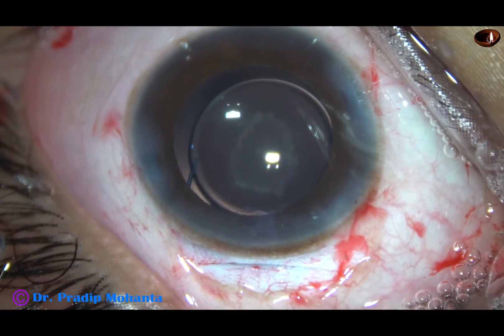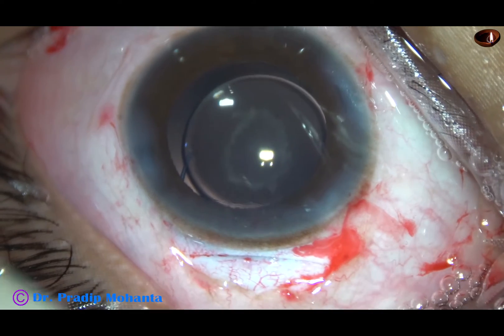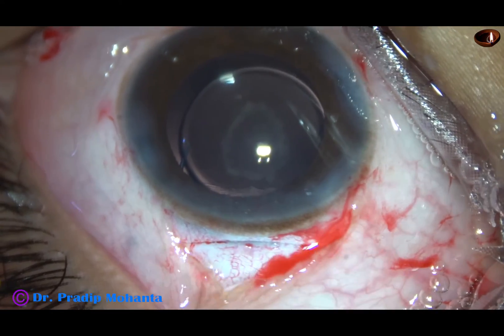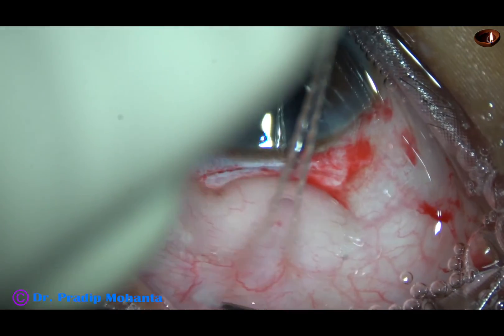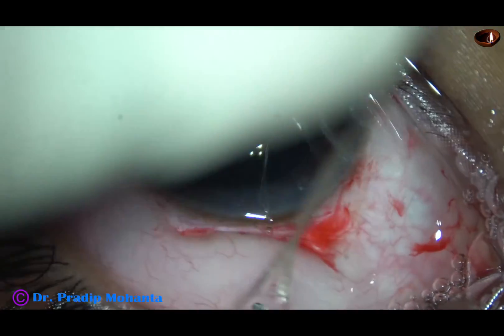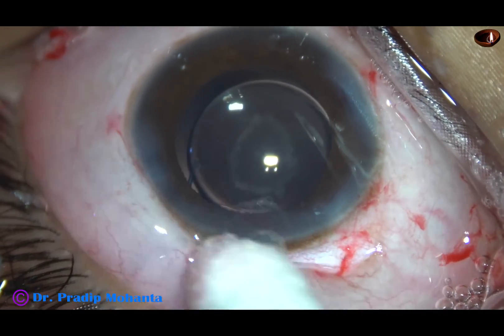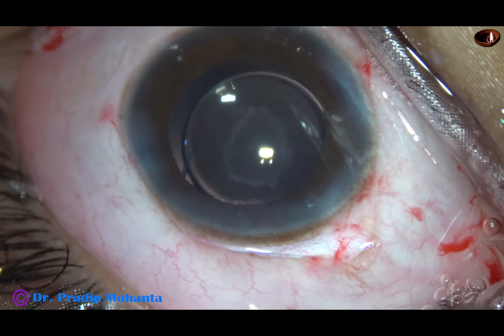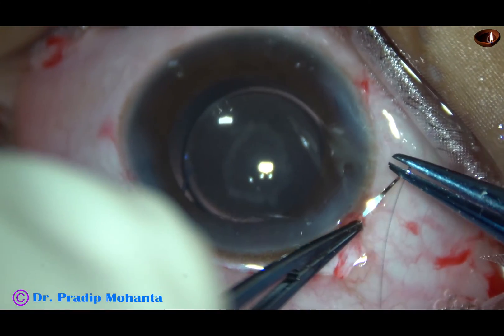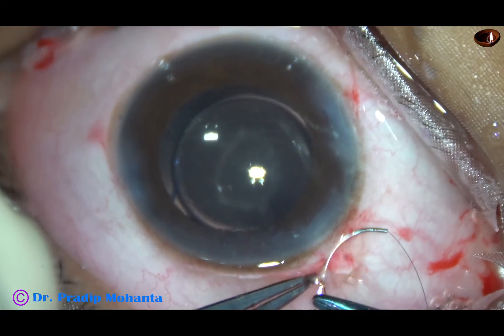Now the conjunctiva has to be opposed to the limbus. My plan is to inject subconjunctival dexamethasone and gentamicin so that chemosis occurs and the conjunctiva comes forward. The superior rectus bridle suture is removed. And now I am going to use a single releasable suture at the right end of the peritomy. Instead of using cautery to oppose the conjunctiva to the limbus, I am using this releasable suture.